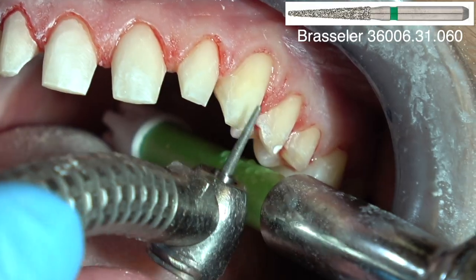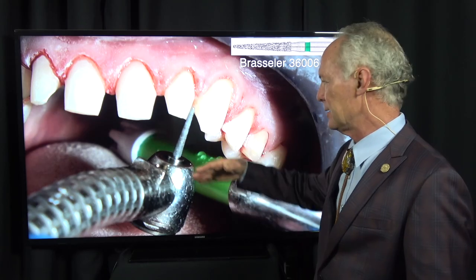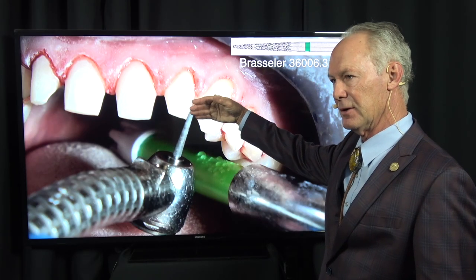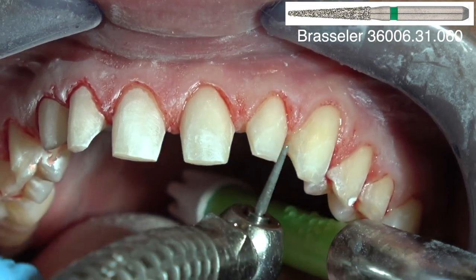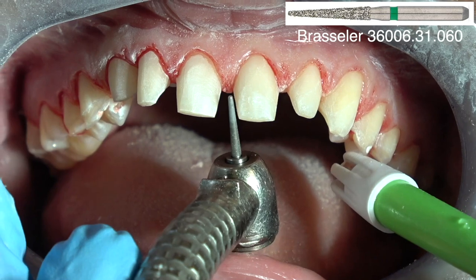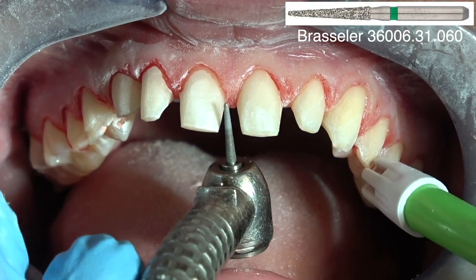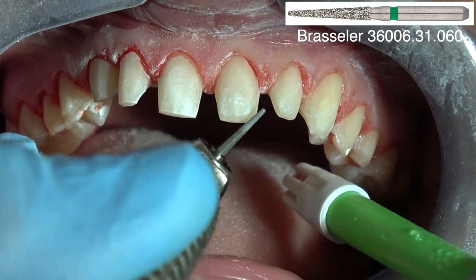Sometimes dentists will ask in the comment section, do you always include the interproximal contacts? And do you always have a flat incisal surface? Yes, every time, even if it's a single veneer, if it's an anterior tooth. Now, if it's between cuspids, bicuspids, or between bicuspids and a first molar, unless there's a diastema, I don't include the interproximal surface.